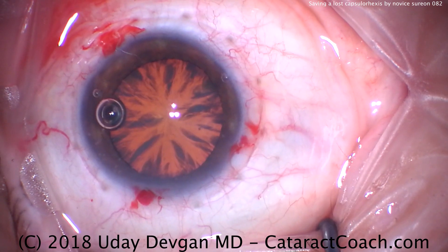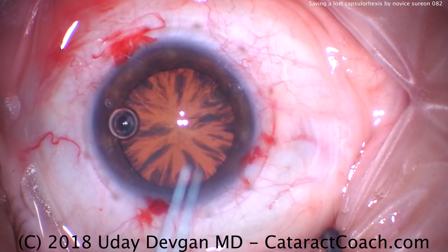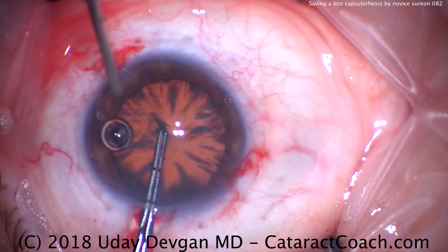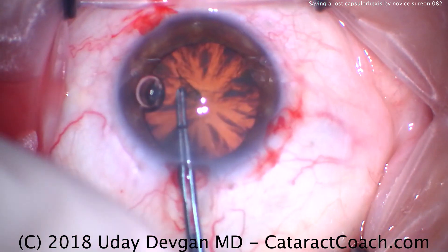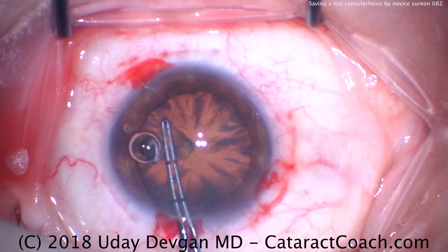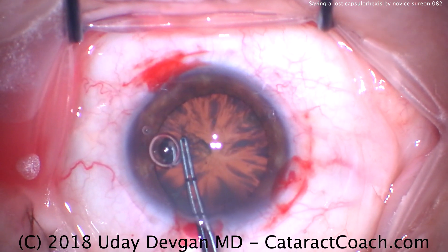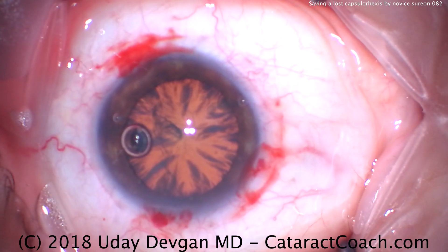Now it's time for the capsulorhexis, and this is arguably the hardest part of the case — not just because we have a novice here, but more importantly the view is terrible. These cortical spokes are going to block the view. The capsule is grabbed, a rexis is attempted, re-grabbing here. It appears as if there's a tiny baby rexis made, but that's not going to be sufficient.